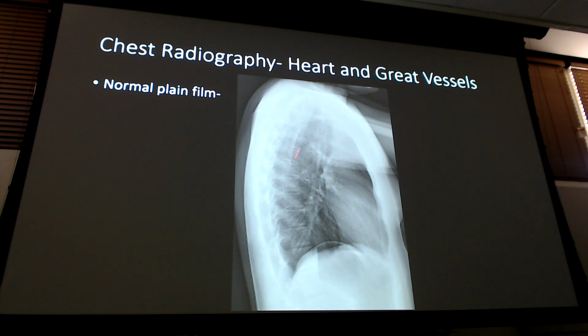If I can't make out my spine, outside of up here, from about right here down on the scapula down, if I can't make out my vertebrae down here, that's probably underpenetrated. So you would say, sir, that this is pretty normal? This is adequate. Yeah, this is normal. There's nothing wrong with this one. No underexposure. This is a great lateral chest x-ray. This is what I would want you to base your normal off of when you're going through the stuff, just running through the areas that I'm looking at to verify that it's normal.